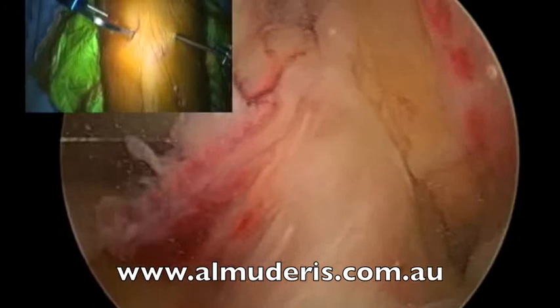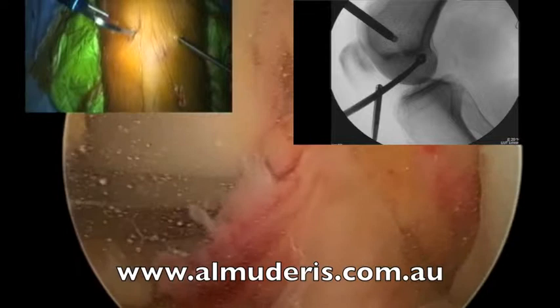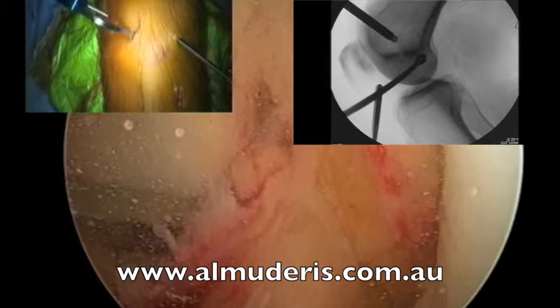Now give me lateral. And up with the machine. X-ray. Now this is a perfect position of the ACL. I am happy with that — it looks very good. That is exactly where we would like the ACL graft to be.